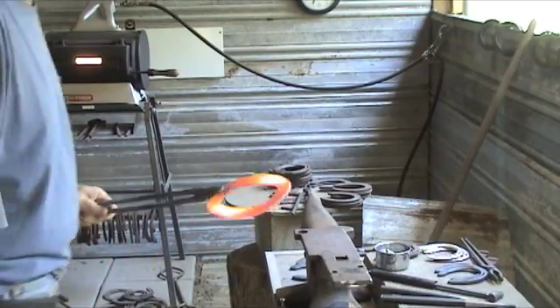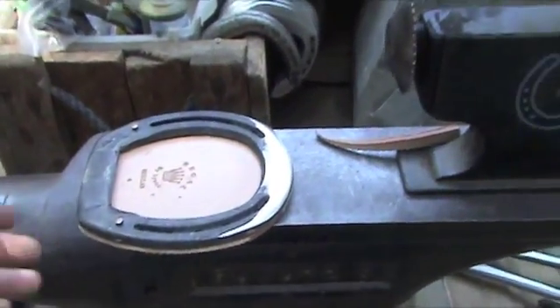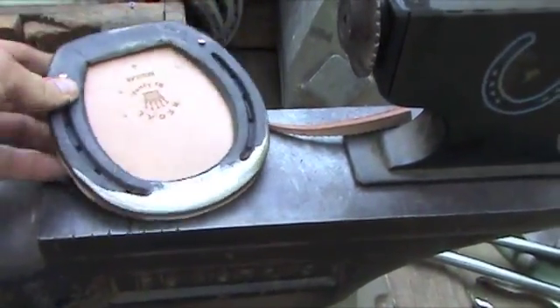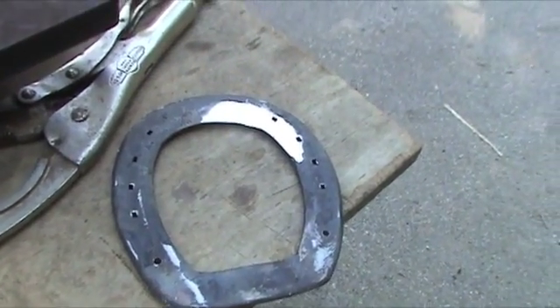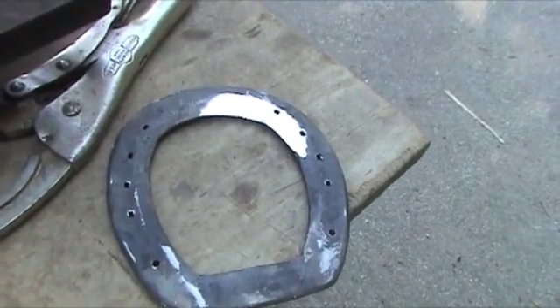Just finishing up Revere's shoe. The shoe is done. Basically we rolled off the whole front of the toe. I grounded out the medial side of the shoe where the sole was prolapsed — I didn't run any pressure there.